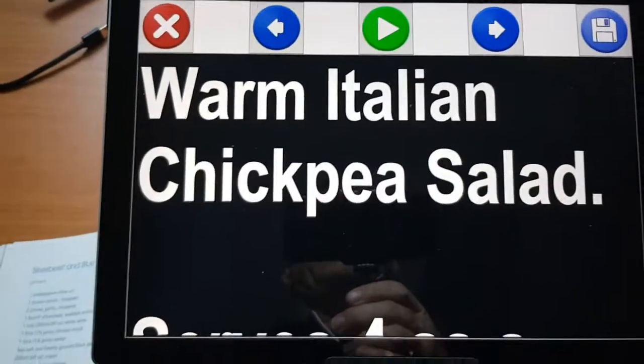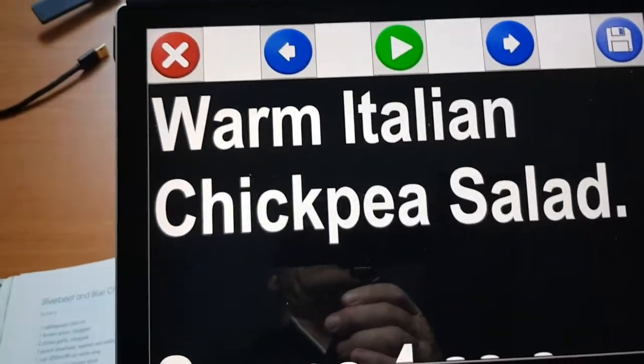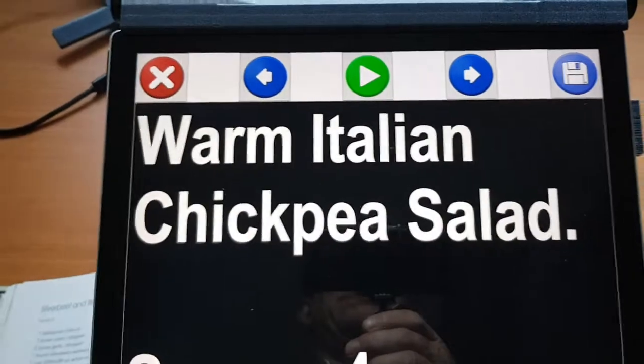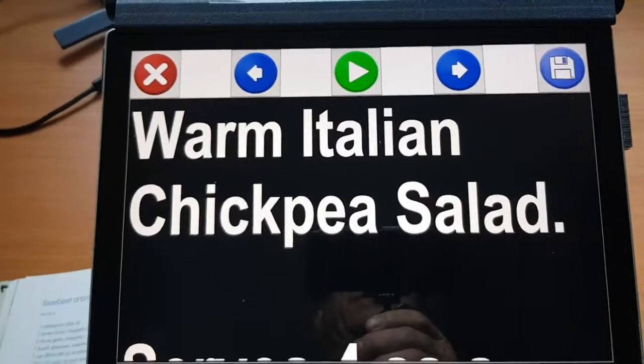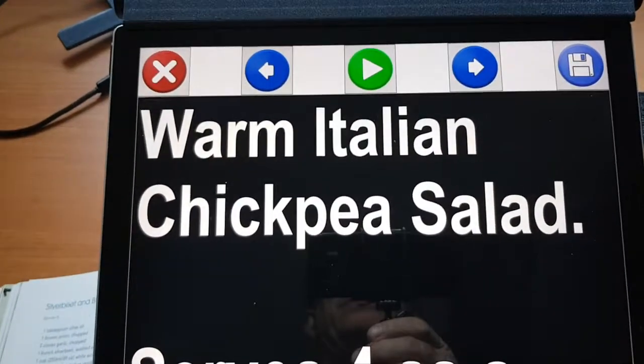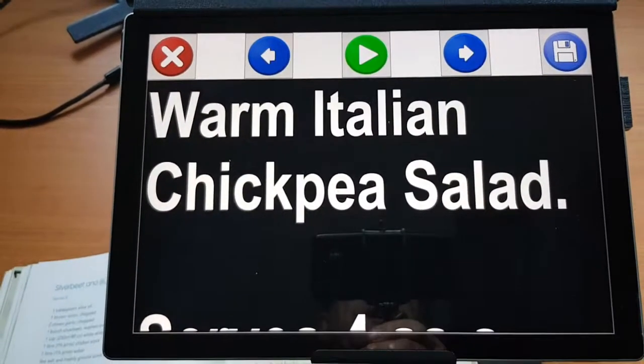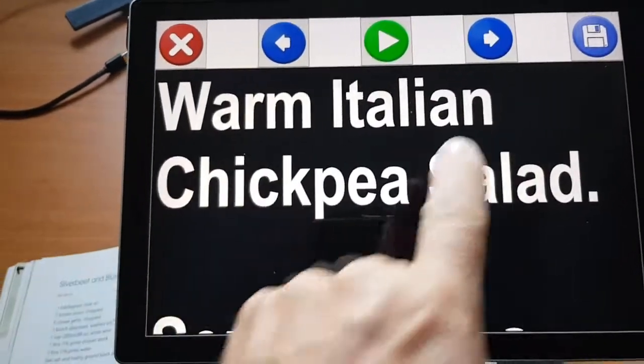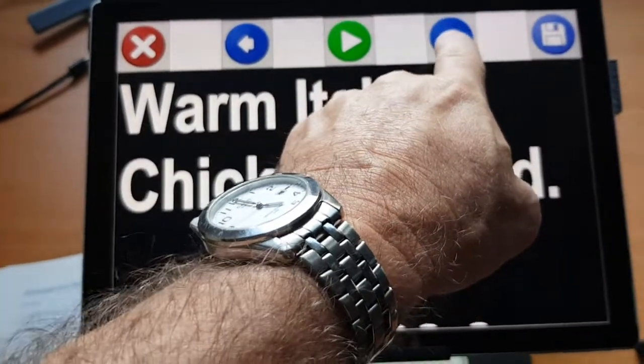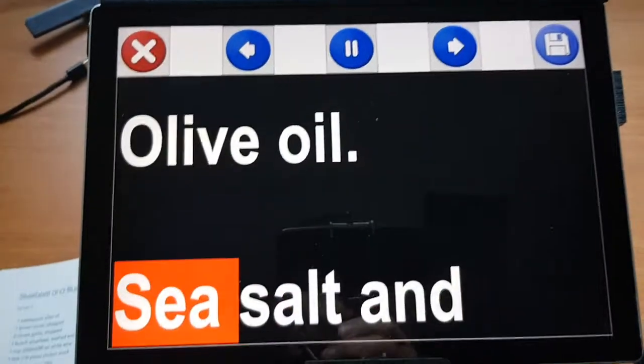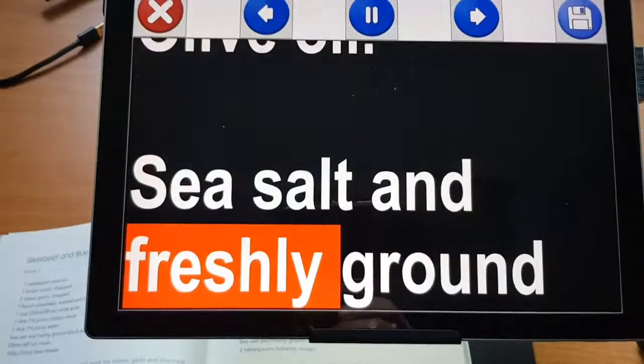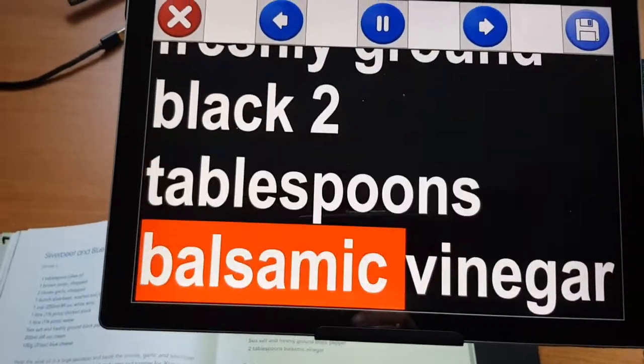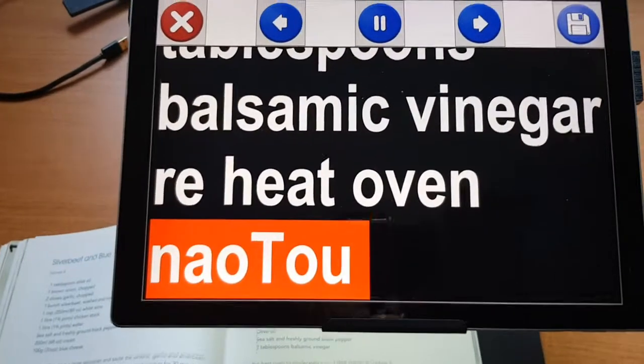This processing is all done within the software, it doesn't have to go to the internet to get any of the OCR happening, so it's not dependent on your internet connection. You'll notice that we have some fast forward controls and so on here, and a moving highlight. I've got this set to a very large magnification, it's a single column.